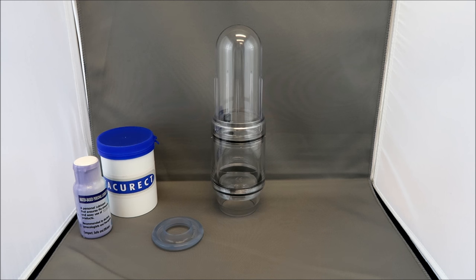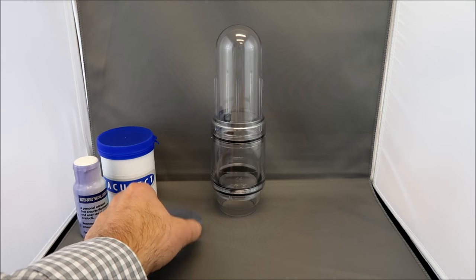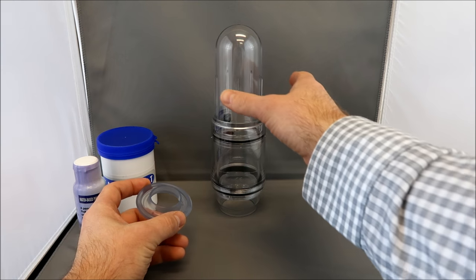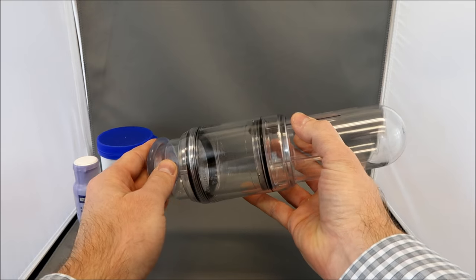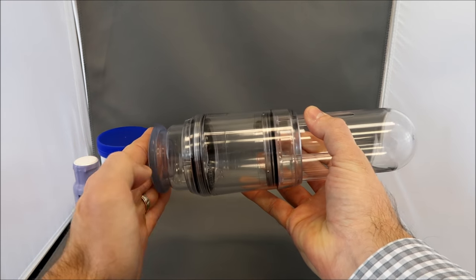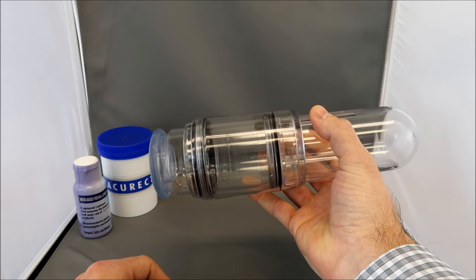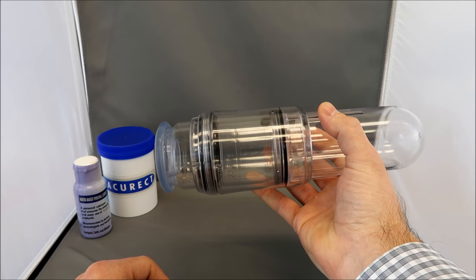The first thing you will do is start with the largest size tension system and place it on the opening of the cylinder. It will fit on the opening just like when you put a lid onto a coffee cup.